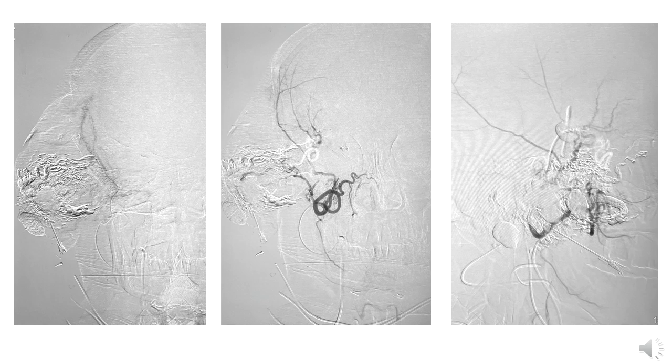Initially I used to embolize with large size particles, but as my experience has increased, now I have shifted towards the lower size particles, which have provided me with good surgical outcome. I have found that complications are not that common with smaller particles. Usually, once I have done all this glue embolization to knock off most of the larger vessels, then the PVA particle is just taking care of these smaller vessels, and I've not really seen major complications till date, barring one case.